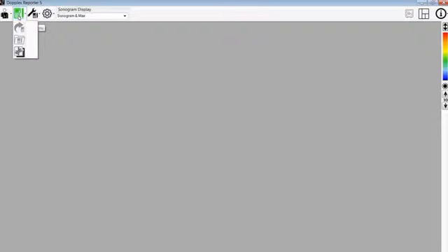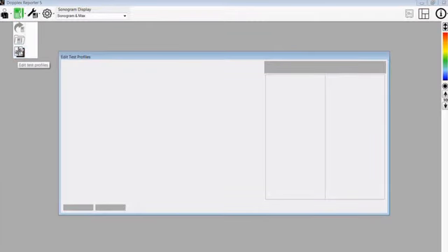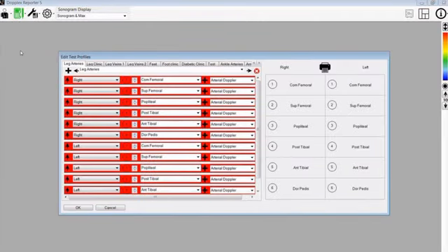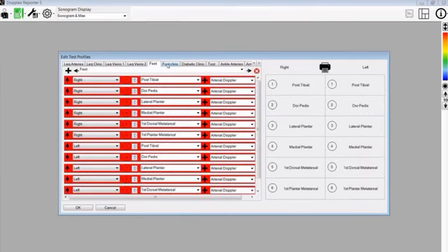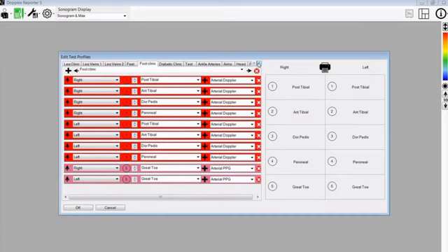To edit the test profiles, go to the Doppler menu and select the Edit Test Profiles button. The different preset test profiles will now be shown. Here you can see tabs along the top of different profiles which have been preset in the software. You can select one of these which match the type of test you are conducting, or you can start a new test or set a new profile.